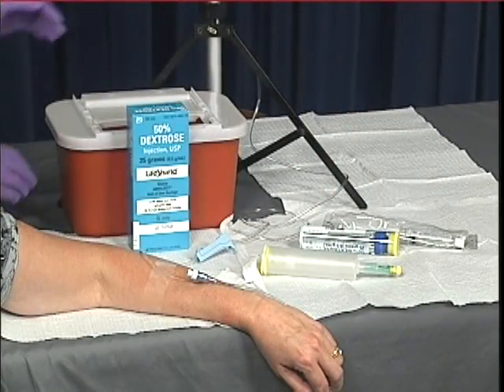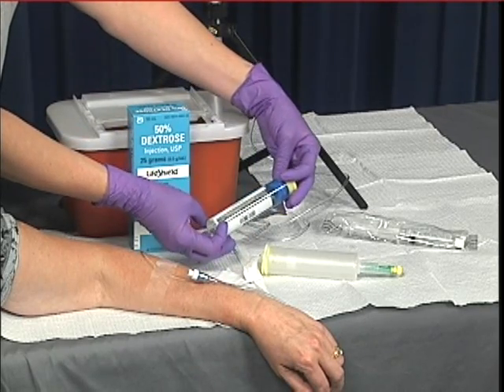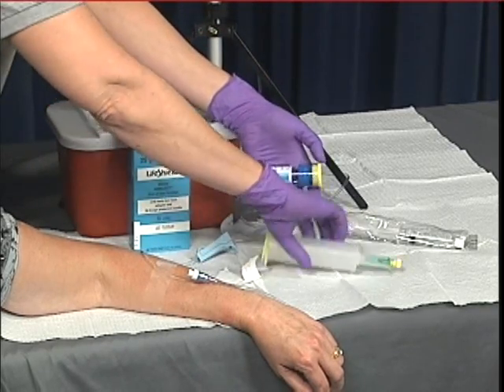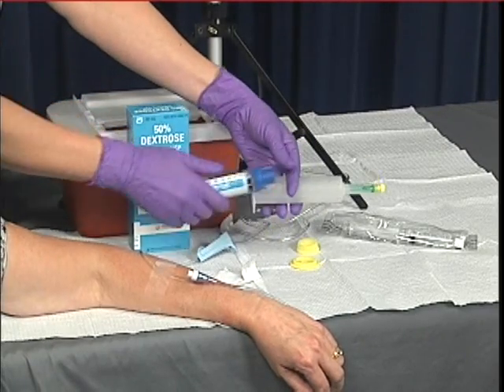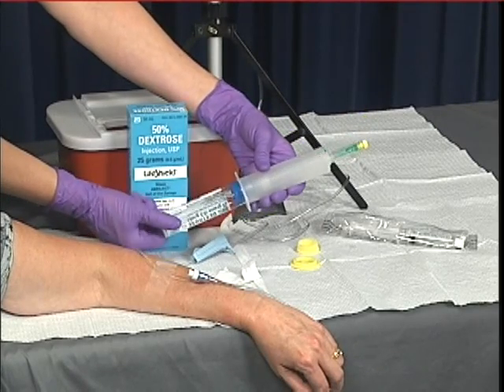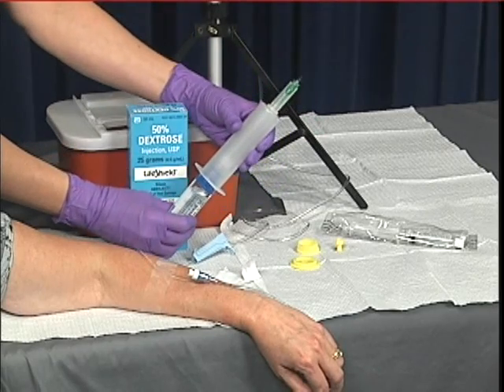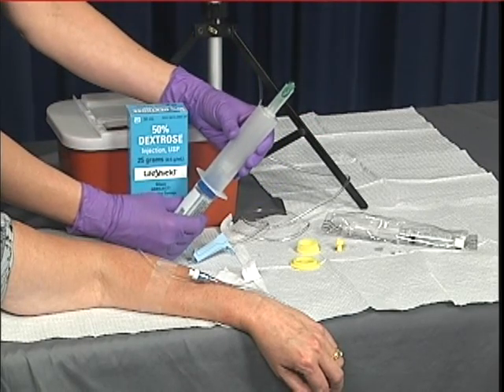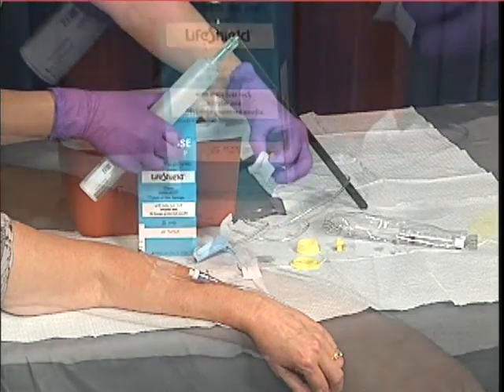Recheck the medication for the patient's rights. Remove the protective caps from the syringe and assemble the medication as previously described, making sure to remove all air from the medication itself. Use an alcohol prep or other suitable antiseptic swab to wipe the surface of the IV tubing med port closest to the patient.